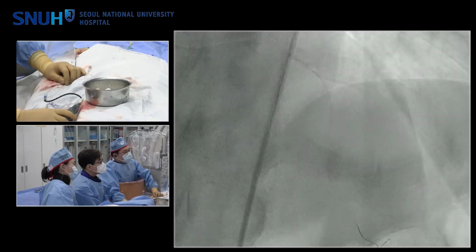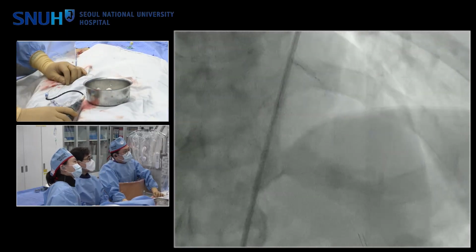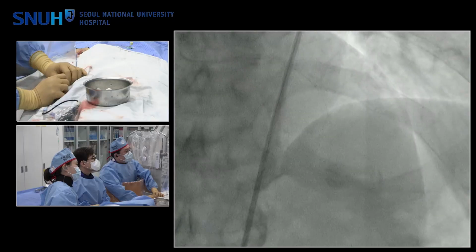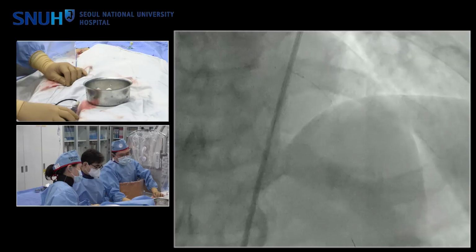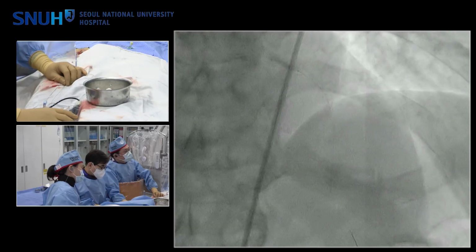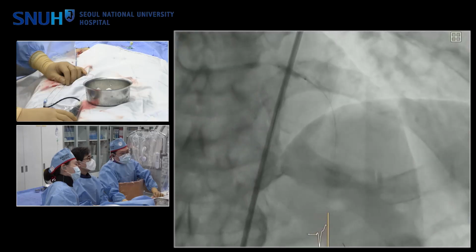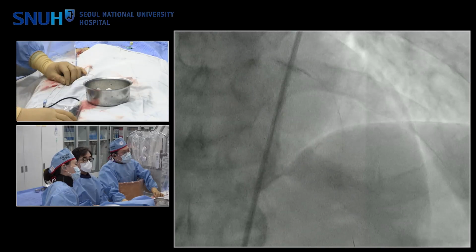I agree. Cutting balloon is actually my first choice for this case. So Dr. Kim? Actually, the preparation of a balloon is very important because this is a very weak, low pressure balloon. So air preparation is critical. Have you tried two or three times of negative air preparation for this lesion? We can see some air in the distal part of the balloon.